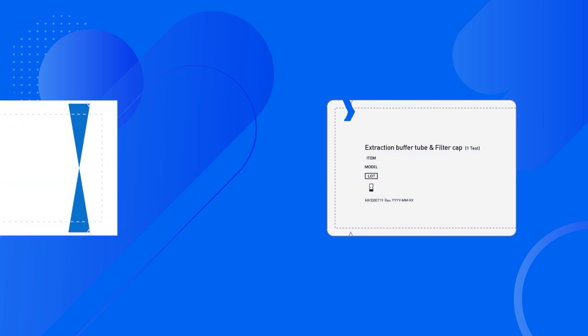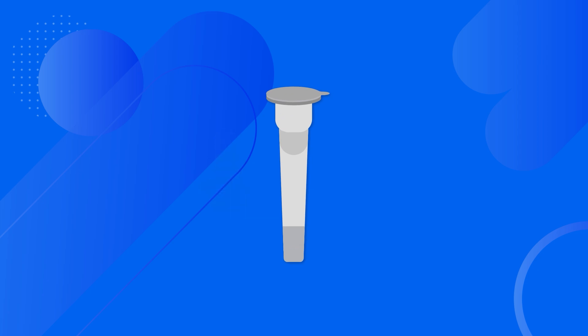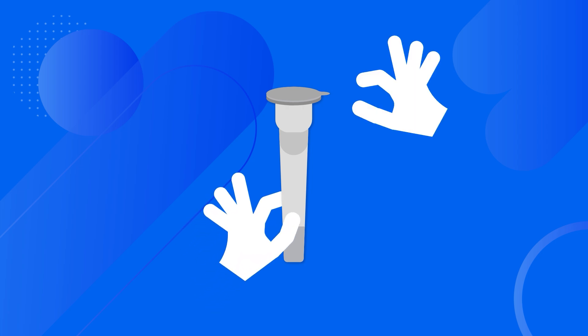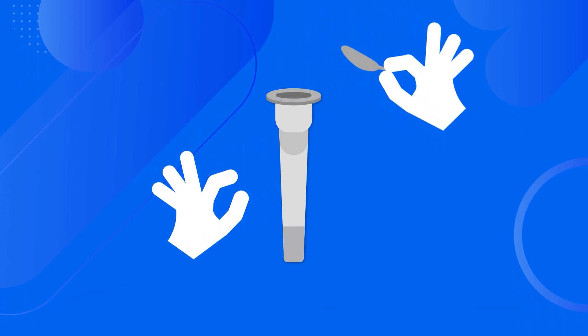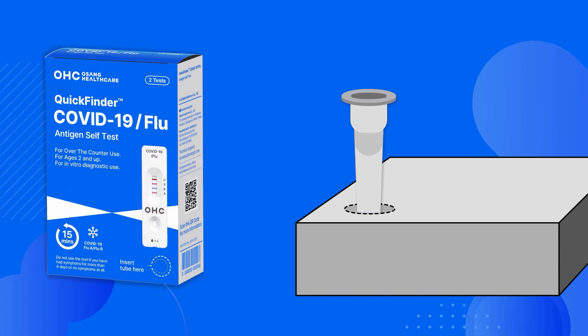Open the foil pouch that contains the extraction buffer tube and filter cap. The white pouch tears open across the short end from a notch in the edge, and the tube and cap slide out. Take the extraction buffer tube in hand and gently peel off the sealing foil, being careful not to spill the buffer solution inside the tube.